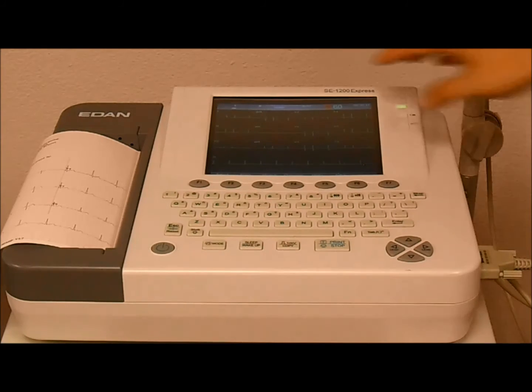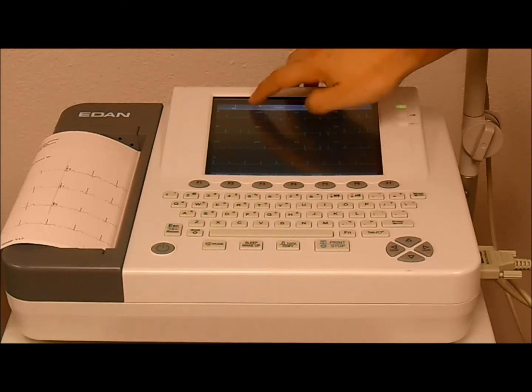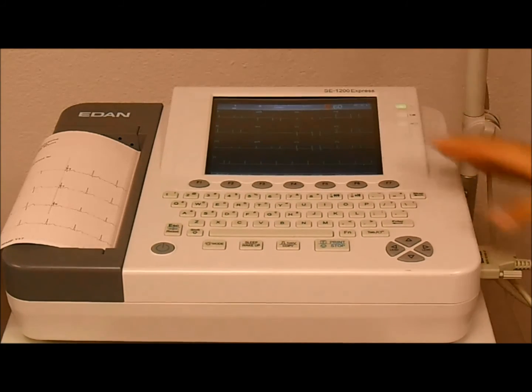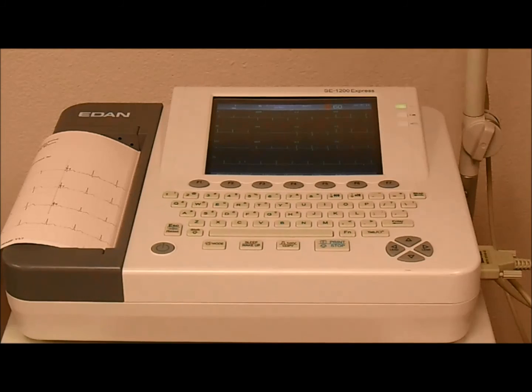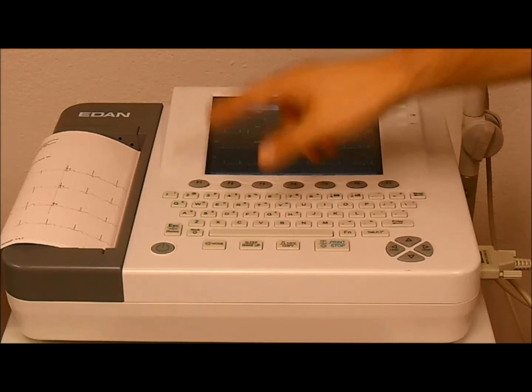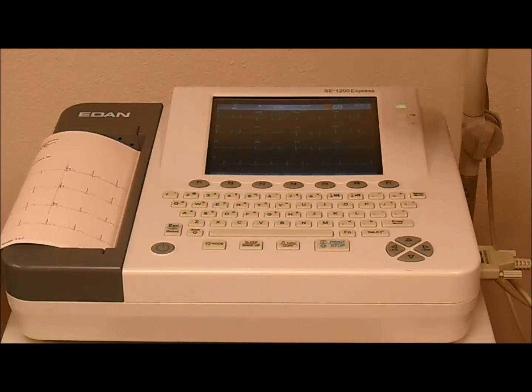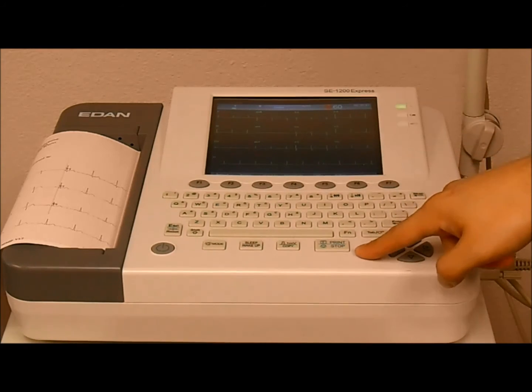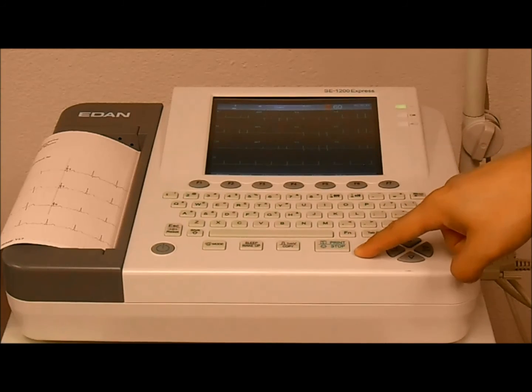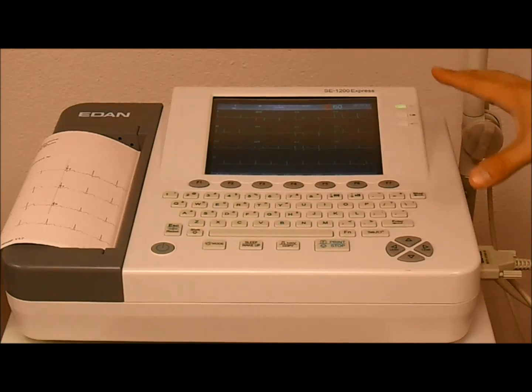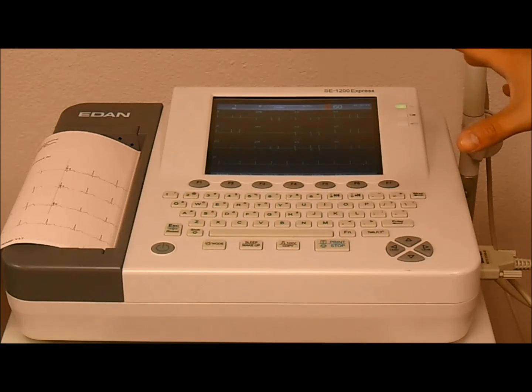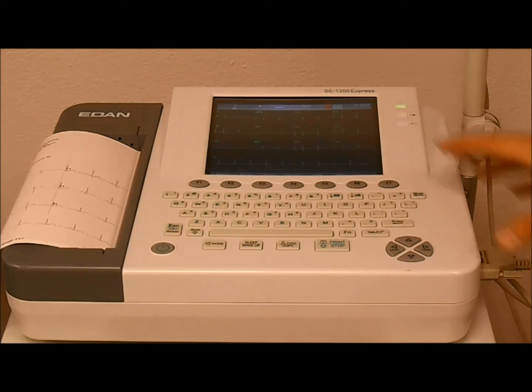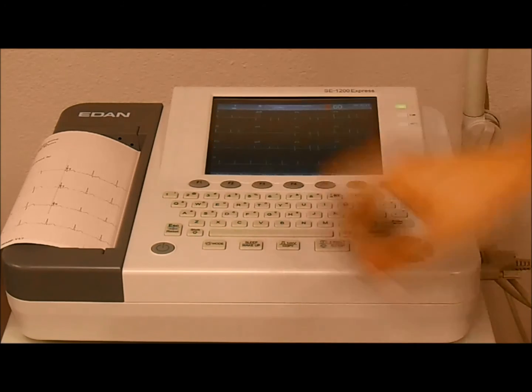Disconnect the leads. Now the patient information is refreshed. Once you have the new patient connected, press F1, enter the patient information, and press the print key. The machine would do a 10 second sampling period, analyze the information, and automatically record the report on the built-in thermal printer.